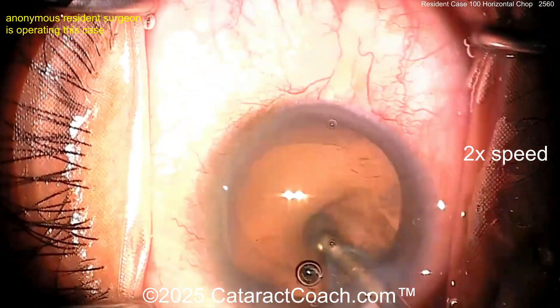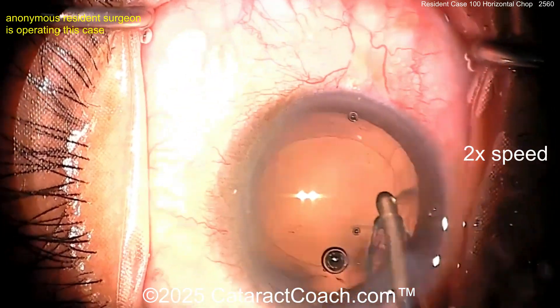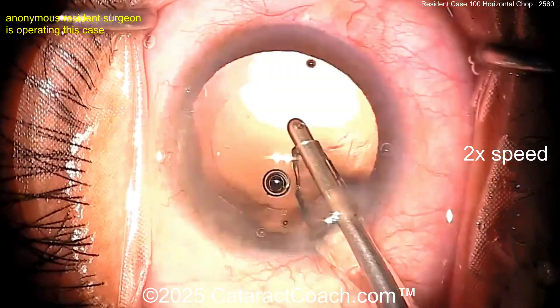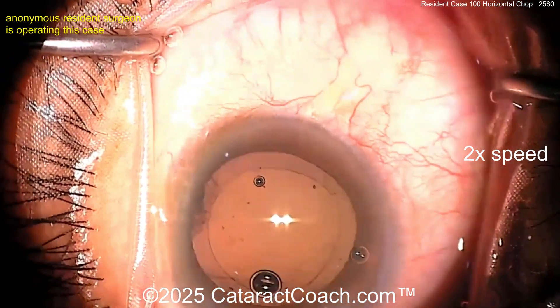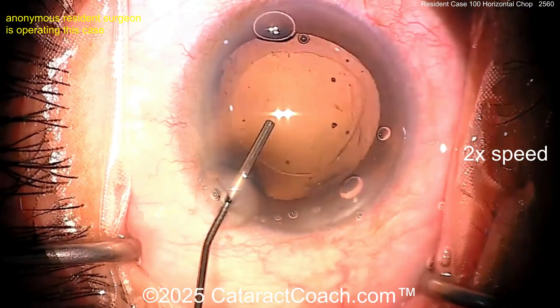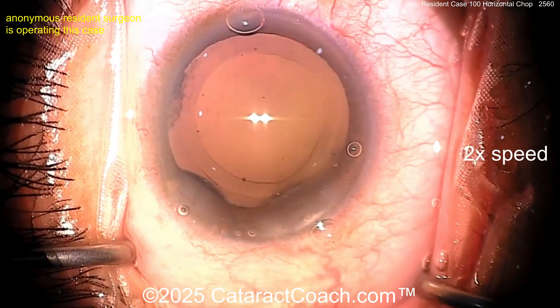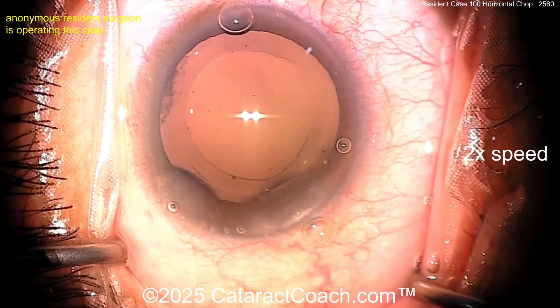Aspirate, aspirate, aspirate — that all looks great. I'm really impressed; it's a beautiful job for case 100. I just can't wait to see case a thousand from you. What a clean capsular bag. Maybe a little bit more material — there are some cells under the anterior capsular rim. Here comes the viscoelastic going inside to fill the bag. That rhexis looks beautiful.